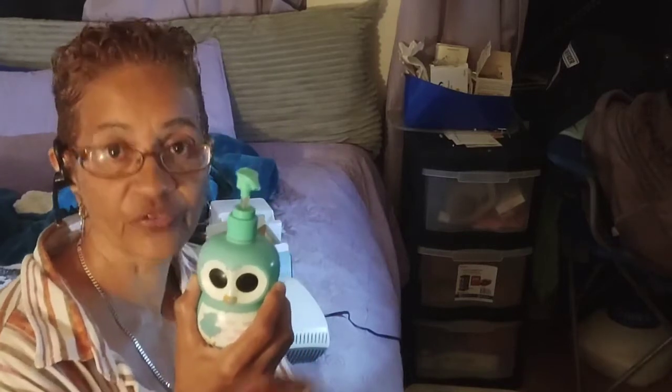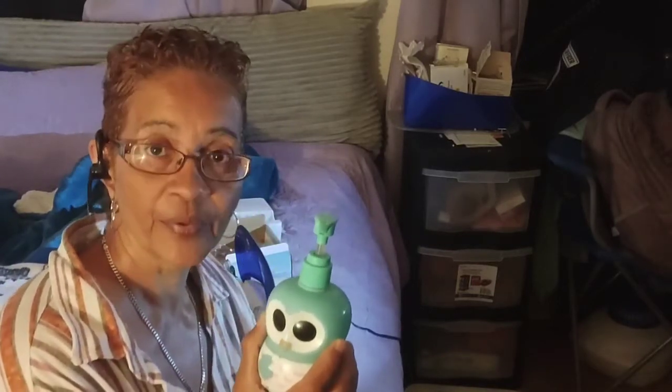So make sure that if you lay it on the side of your console, because it's there, you put it there, make sure you cover it with a thick towel or put it in another cubby hole, okay, your side door, on a pouch or something. Do not leave it exposed to the sun, okay? So remember that. And don't forget, get your individually wrapped, because this is on the road, portable, or if you're working, you'll have it in your locker or in your bag if you need it.